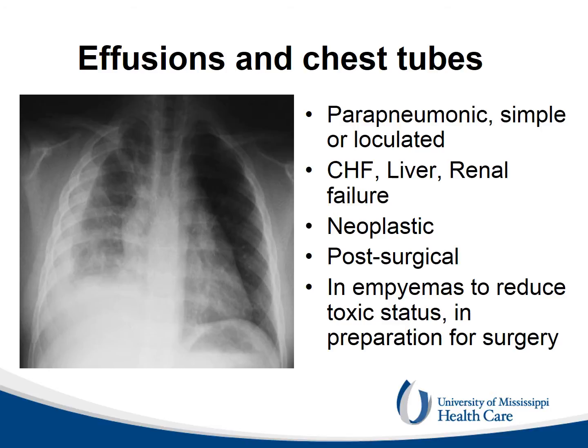If drained, the fluid needs to be sent to the laboratory for the differential diagnosis between transudate and exudate. The ratio between the serum and pleural fluid LDH is the most reliable single parameter for the diagnosis. If the fluid looks cloudy, it needs to be sent for culture and sensitivity.